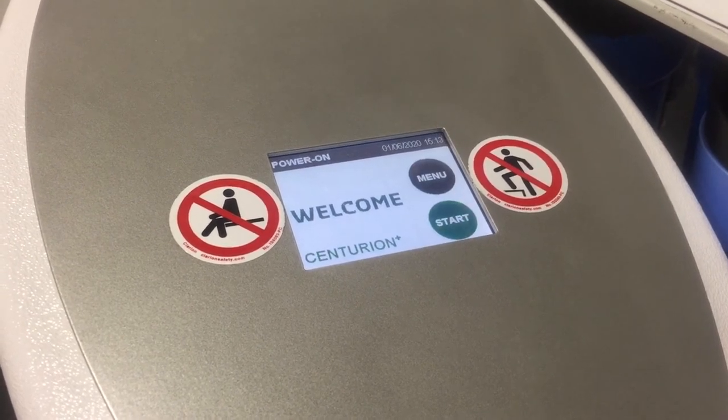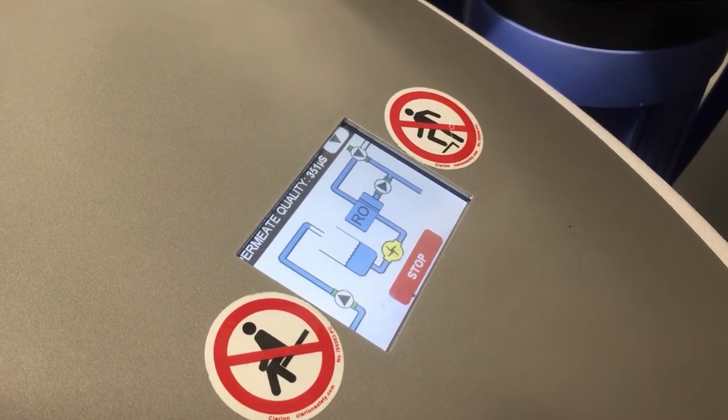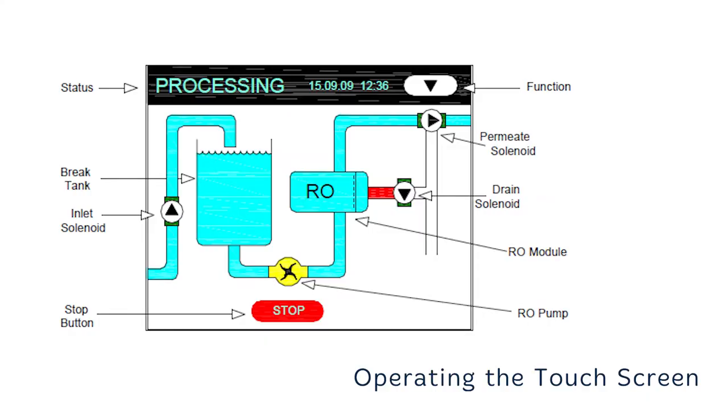During initialization, the unit will sound two beeps indicating that the audible alarm is functioning. To start the unit, select the start button. The screen will change to processing, which will display a mimic of the unit's operation. The unit will then carry out a high flow flush to drain, followed by an internal permeate rinse. After 90 seconds, the permeate will automatically flow to the dialysis machine if connected. To stop the unit at any time, press the stop button on the screen.